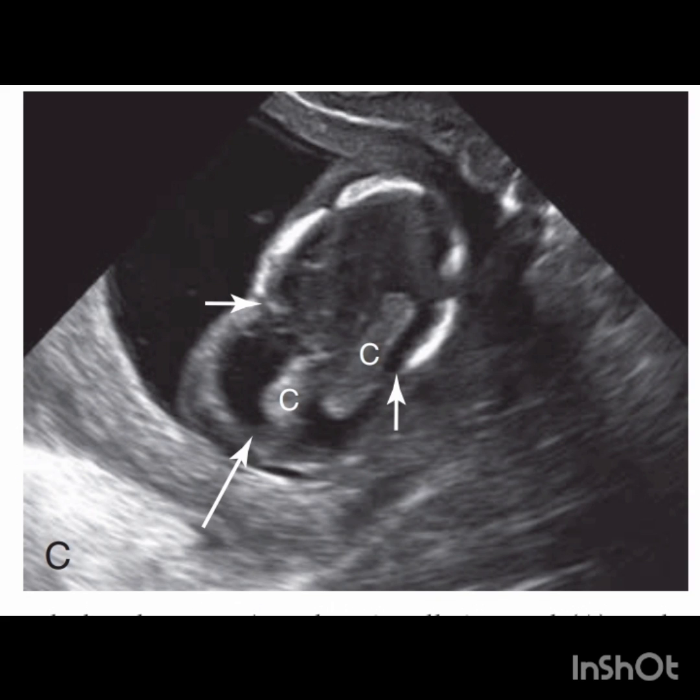This image shows a large encephalocele indicated by the long arrow. The encephalocele also contains two choroid plexuses indicated by the letter C. The calvarial defect is indicated by the two short arrows.